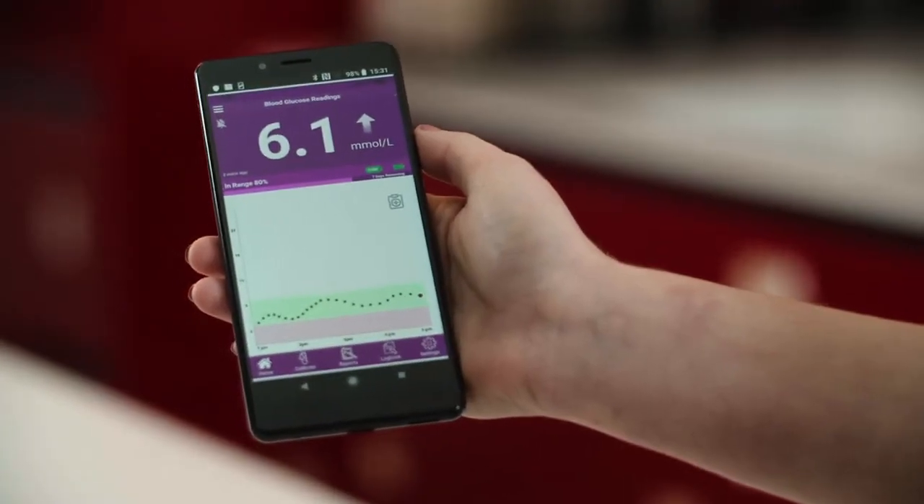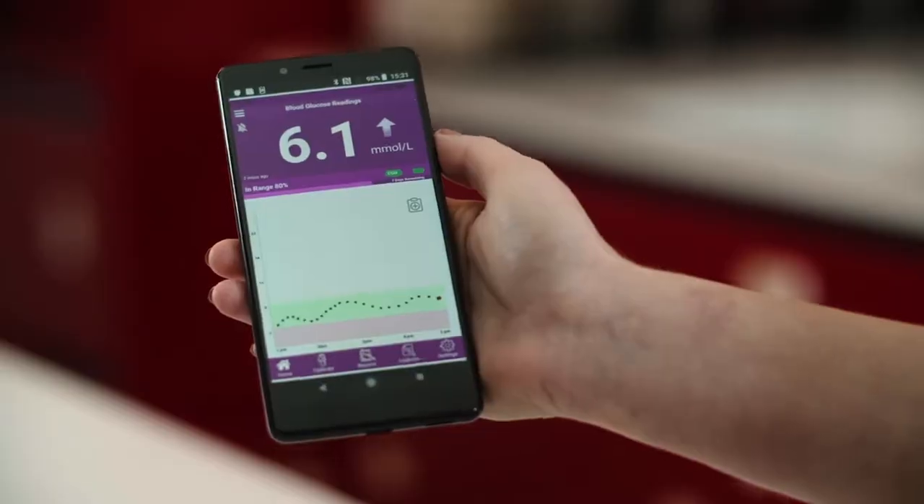The chart shows you the last 3 hours of readings, and you can scroll back through the last 7 days of readings. By pressing the Add Note button, you can add your insulin amount, carbohydrate intake, any exercise, and any medication you have taken. All this information is stored in the logbook of the app.